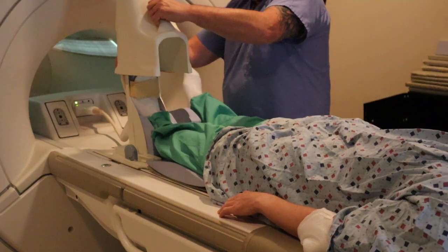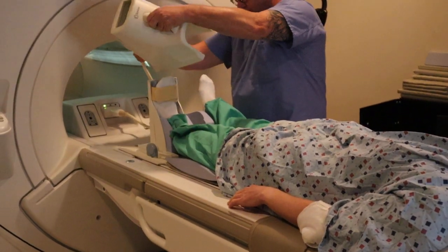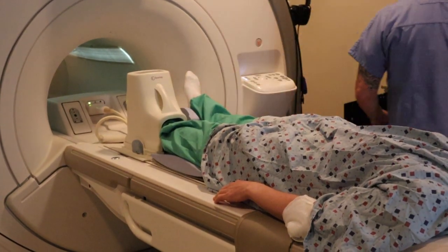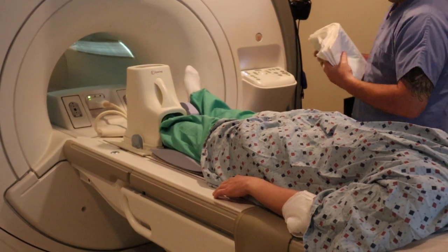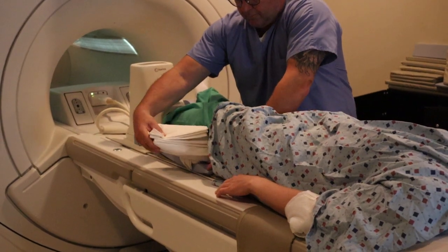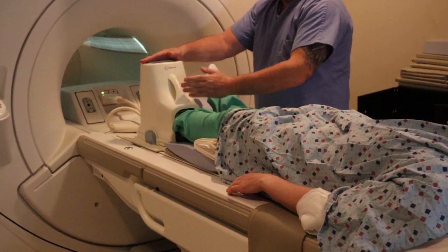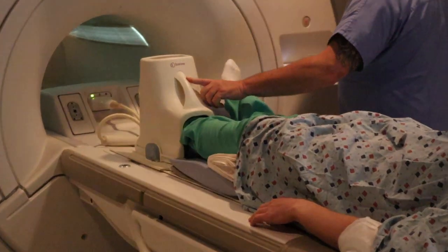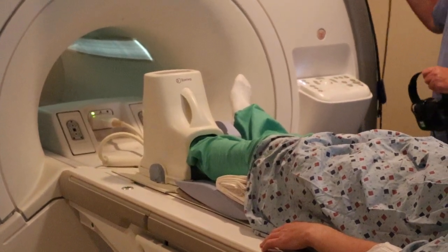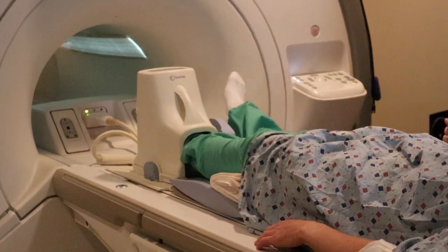Attach the coil. You're going to landmark for the ankle about right at the ankle joint. In some cases there should be markings on these coils. For the ankle you're going to be at the ankle joint, and for the foot you're going to be landmarking a little bit lower to run directly into the top of the foot.